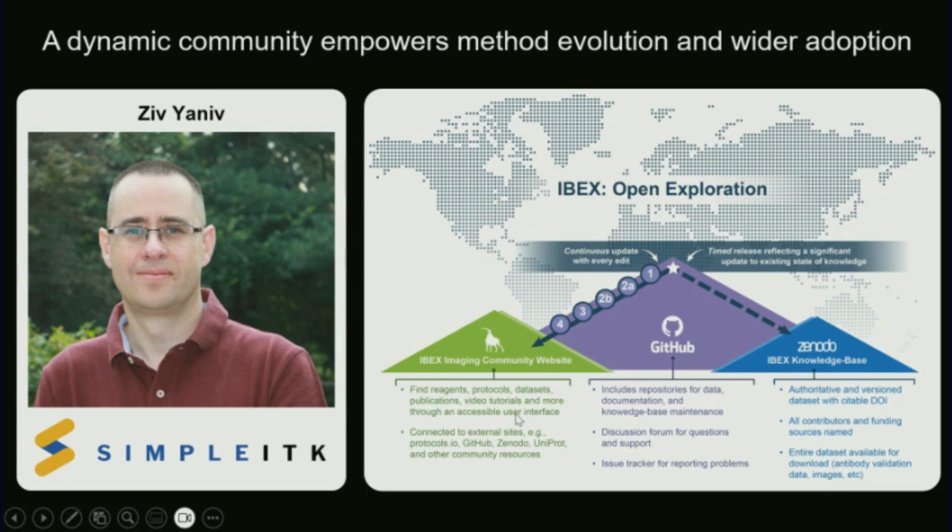And this is where we link out to reagents, protocols. Nothing is hosted really there. It just links to other material. And it's just a more user-friendly way of sourcing and searching the data, because we really call this a data set, not a website. And then when we've reached a significant level of knowledge, we do then a release to Zenodo, and that's a great way, as we see, the knowledge base.